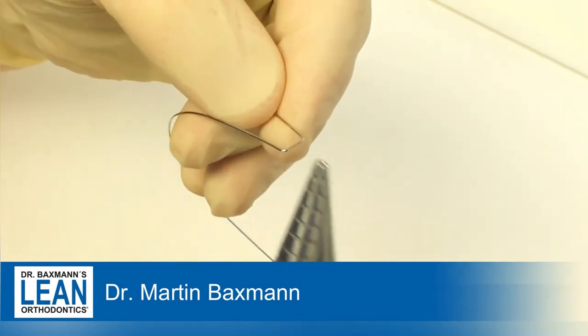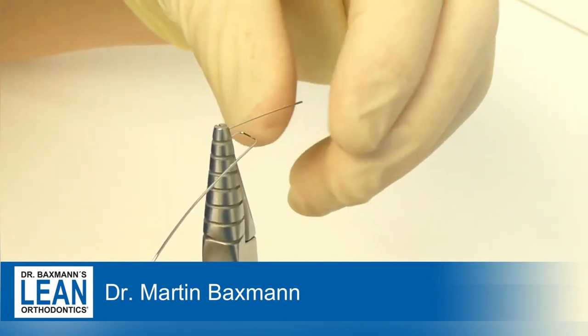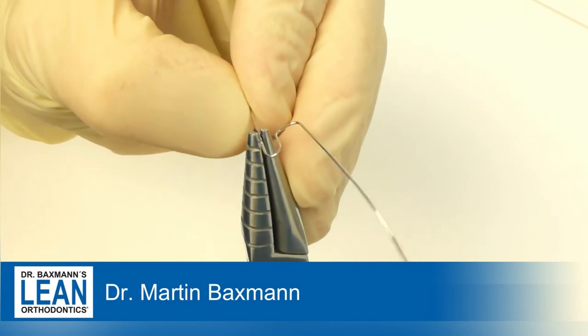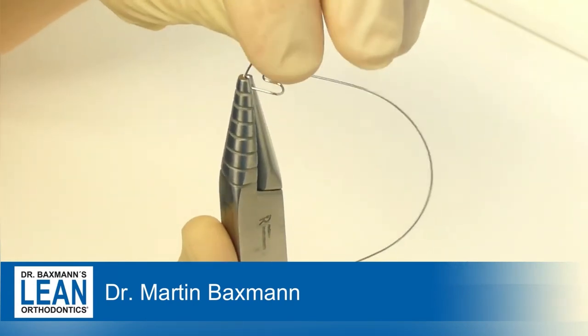Remember the plier holds and the hand bends. We need sufficient space for the loop so we have enough arch length, but at the same time we shouldn't irritate the gum as well. The size of the loops should be about 3 to 4 mm.